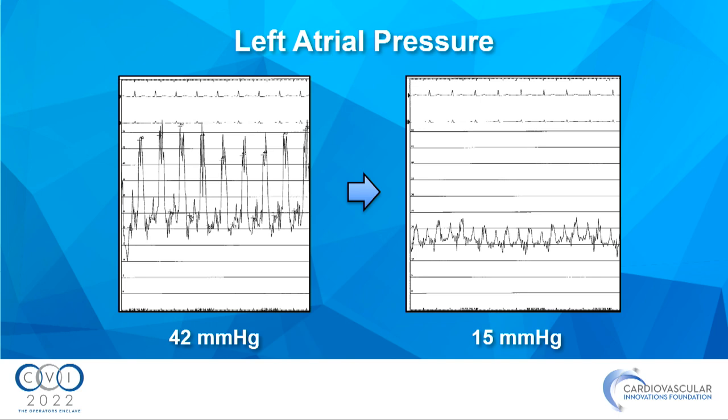So, Paul, when you made that assessment, was there a balloon pump in? Oh, yeah, there is a balloon pump in. Did you turn the balloon pump down when you assessed? Yeah, actually, we did. It was okay. The LV actually looks hyperdynamic, you know, for someone that's had a papillary muscle rupture and a big infarct. I was surprised. Yeah, the walls are moving. All the walls seem to.